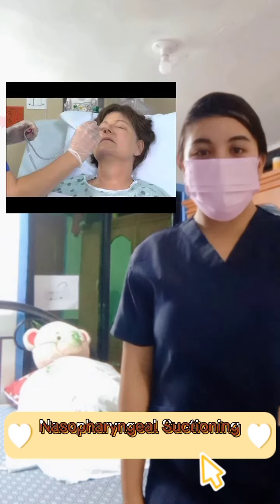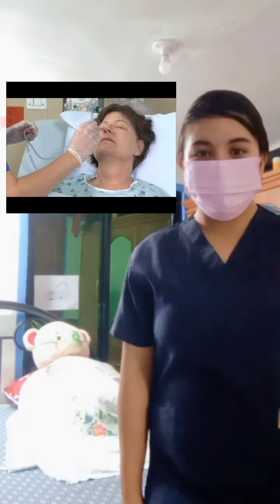Today I'm going to perform the nasopharyngeal suctioning. The purpose of this is to remove the secretions from the airway and to facilitate ventilation and also to obtain secretion for the diagnostic procedure and to prevent infection.